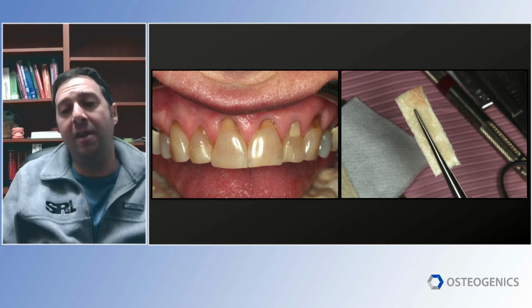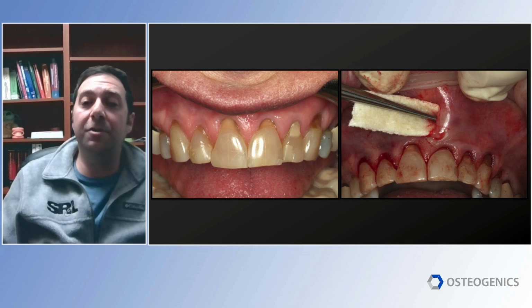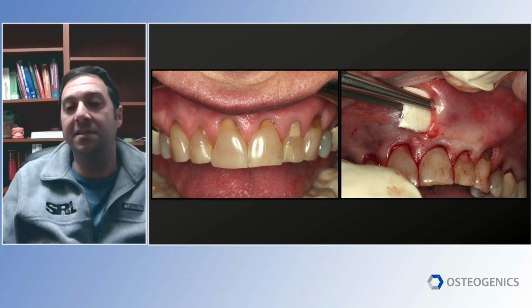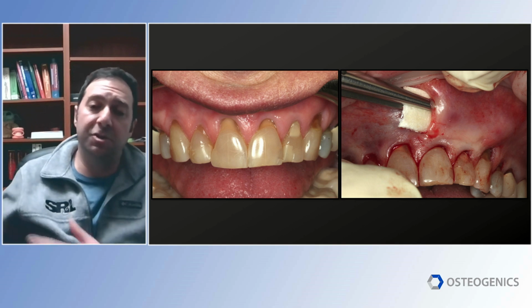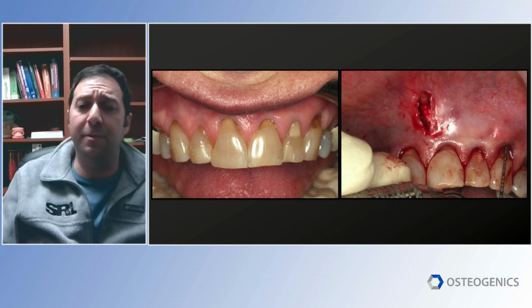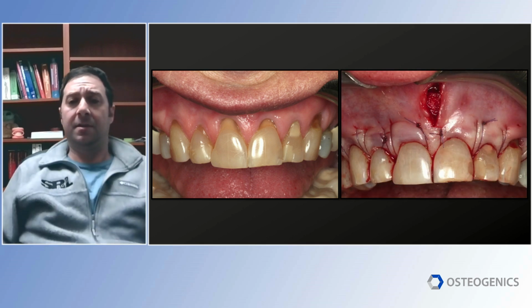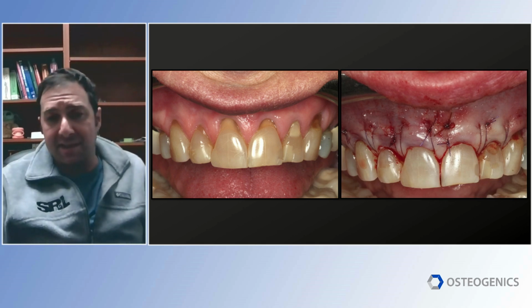Here I have it on straight cotton pliers, long straight cotton pliers that I use to insert the Microderm, inserting it all the way to the most distal location. There it is, very passively inserting it. You have to make sure that, just like you're doing ridge augmentation, you have passive release of your flap. There's my Microderm inserted. I'm using a periodontal probe to make final touch-ups of the final adaptation, my sutures, sling sutures, and then I close up the vestibular access incision.